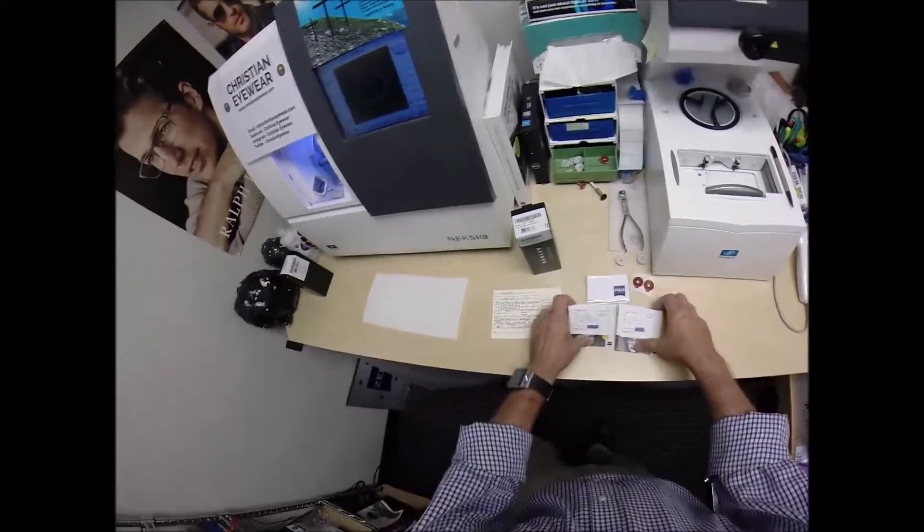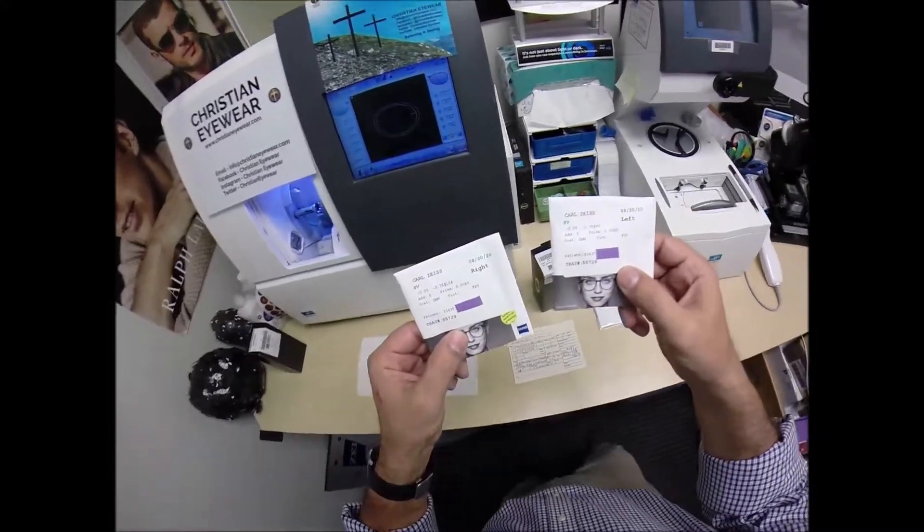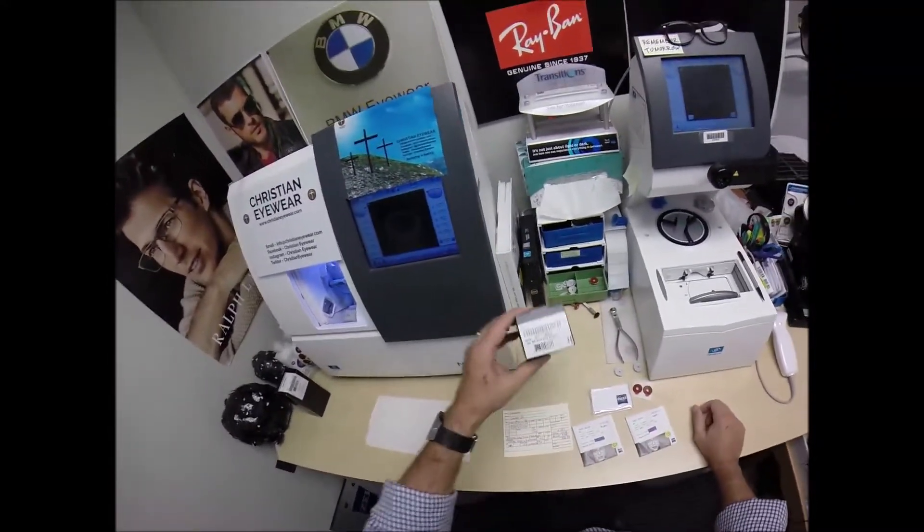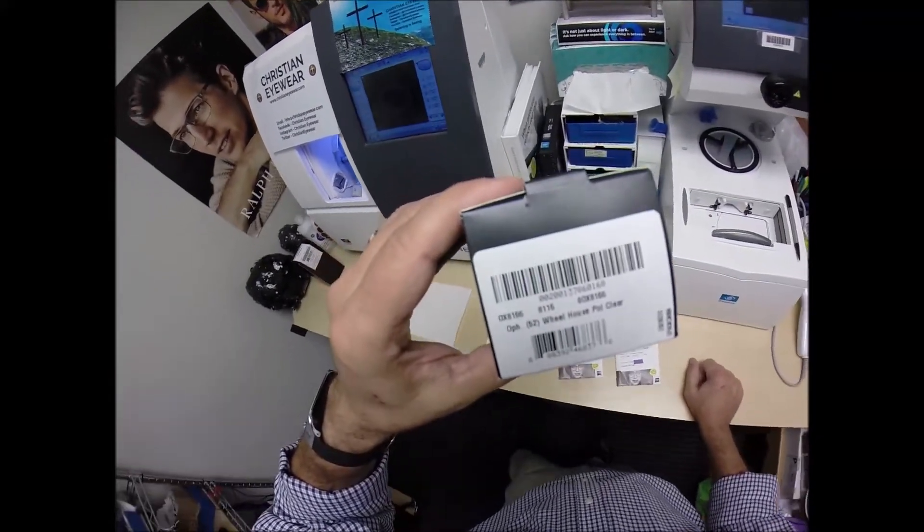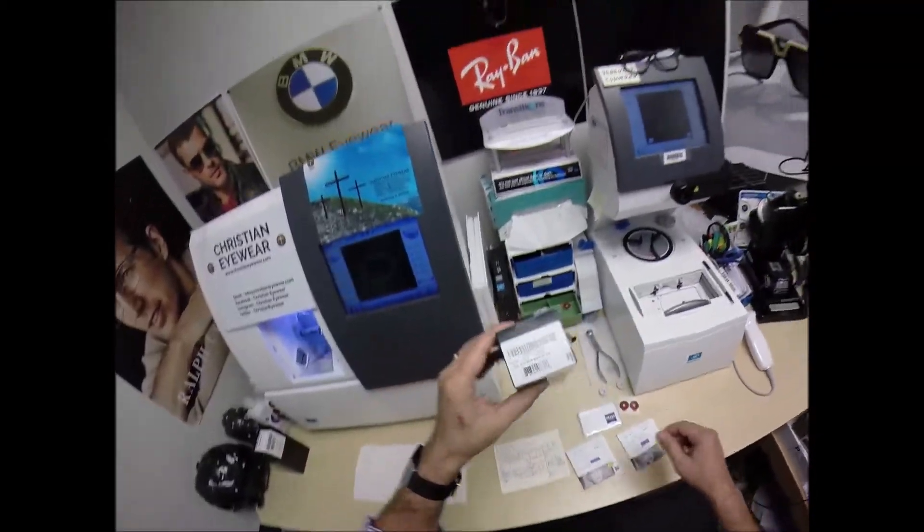I'm going to cut the Zeiss Photofusion Extra Gray Lenses with the Silver Flash Mirror for your Oakley 8166, which is the wheelhouse, color 02, the polish clear in the 52 eye size.